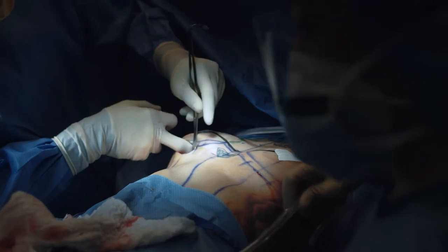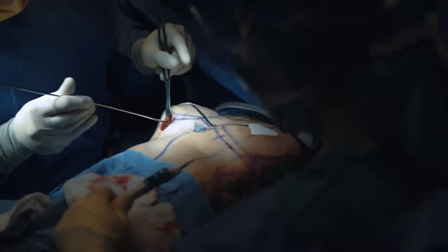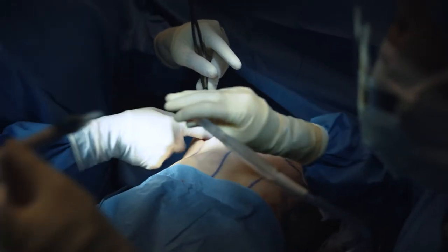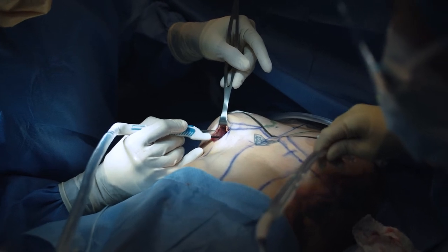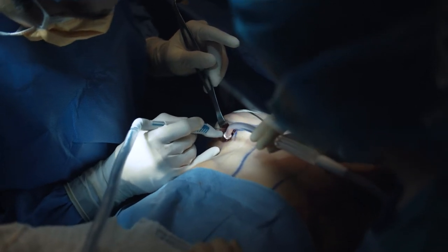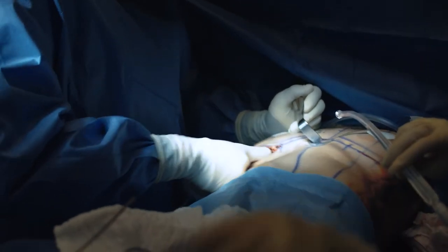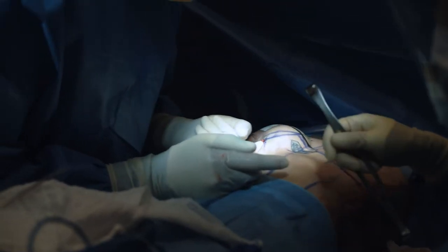Okay, now I'm going to take the suction first. That's good. On. Very nice. Off. Cautery. Now I'm going to gently open the muscle with my monopolar cautery. Now we're going to release it medially, or in the middle.